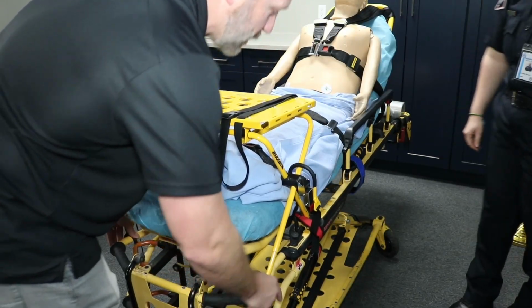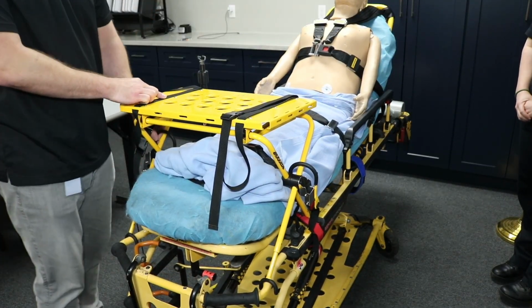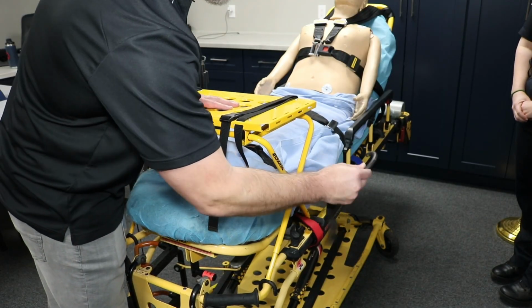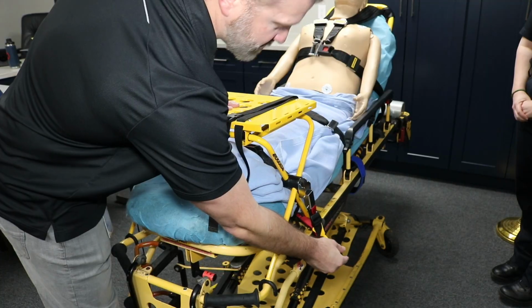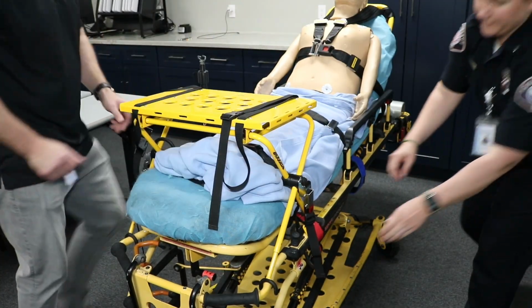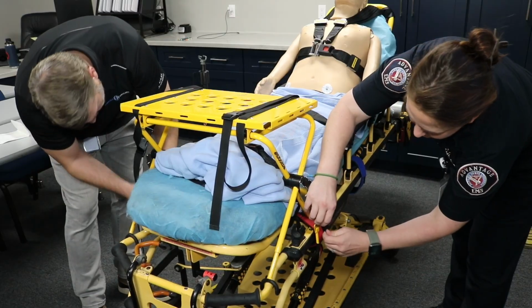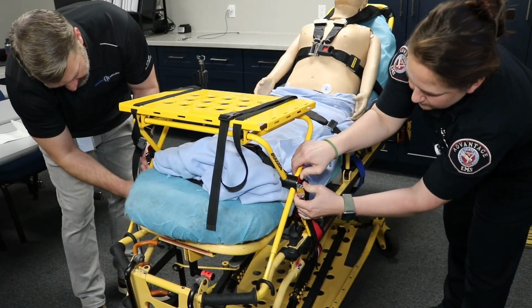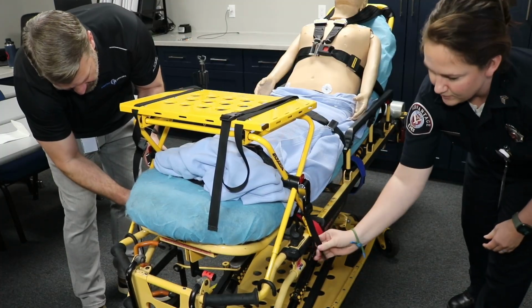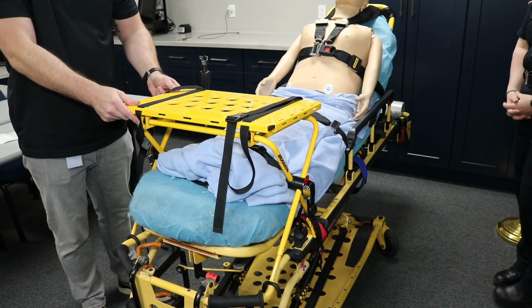Make sure that our points of contact are all on there. And then we are going to come in and make sure we attach our hooks here, hard points of contact, and make sure it's secured. Lauren's going to come in and work that side while I come in on this side. Here, flip it up to tighten it and make sure we pull down on the strap to make sure that it is fully secured. Give it a little wiggle, make sure it doesn't move.